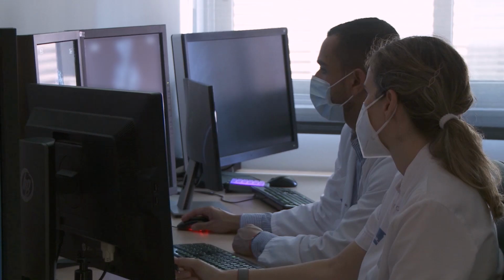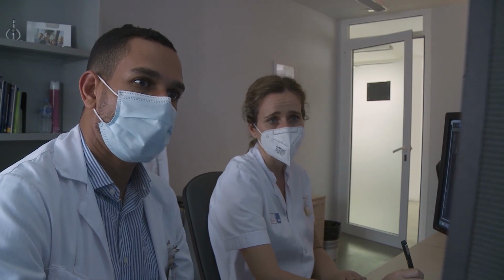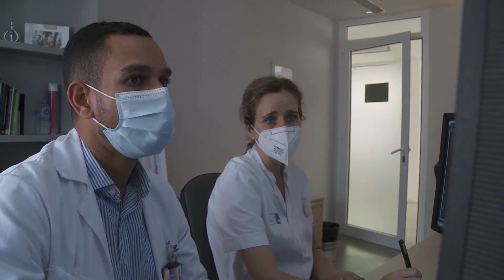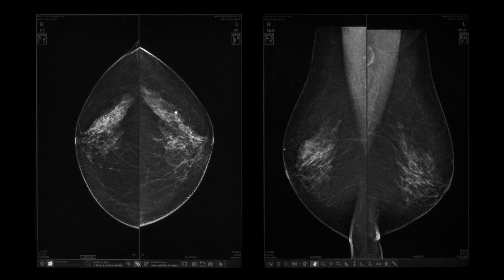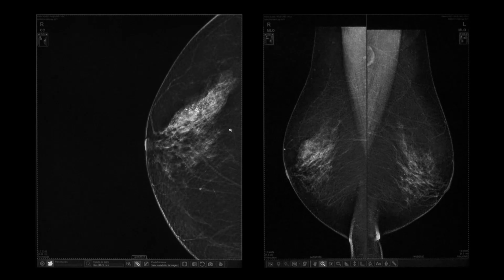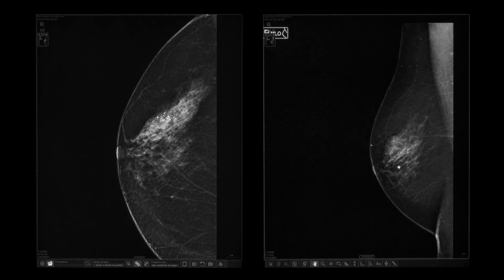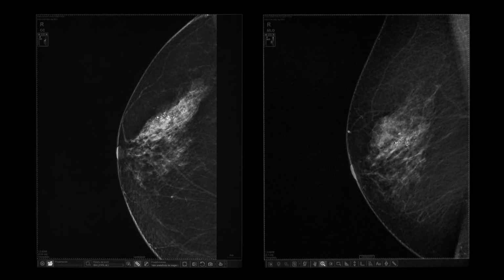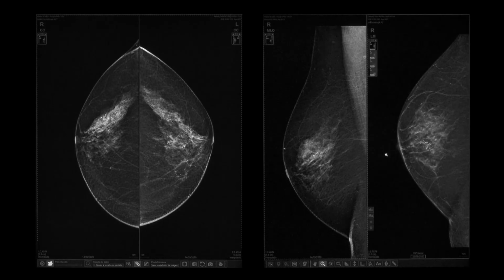When performing a biopsy, it's essential that both the radiologist and radiographer carefully review the case in advance, together. There is also one golden rule. Try to use the projection which gives the best view of the lesion and also the access route with the shortest distance from the skin, making it as comfortable as possible for the patient. This will facilitate targeting, optimize timing, and therefore increase success rates.